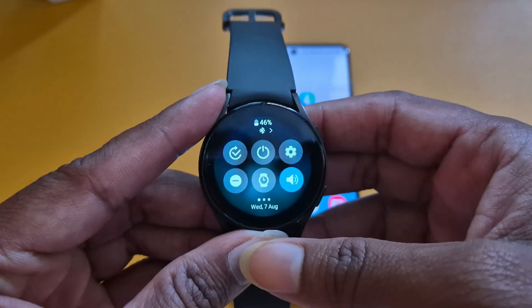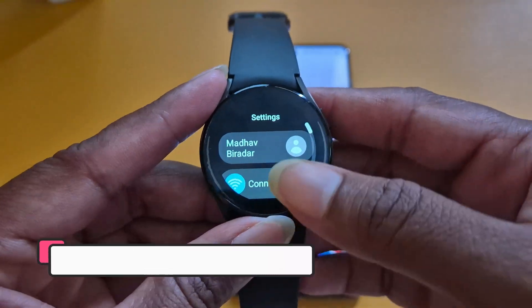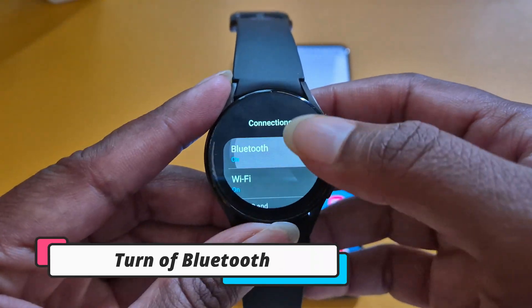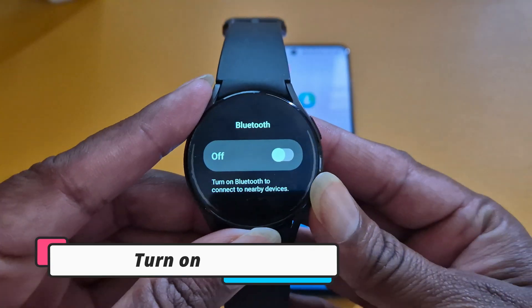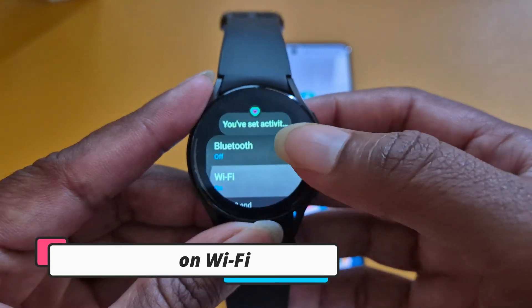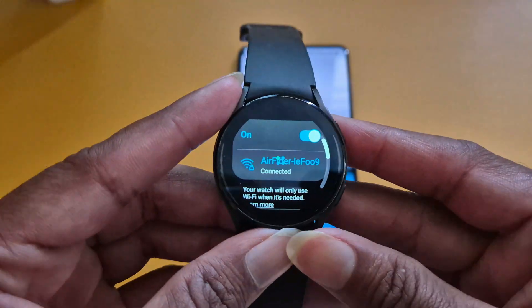Before opening Gemini Man app, you need to make some changes on your smartwatch. On your smartwatch, go to Bluetooth and turn it off for now. Then go to Wi-Fi and make sure Wi-Fi is on and connected to the same internet connection you are using on your smartphone.